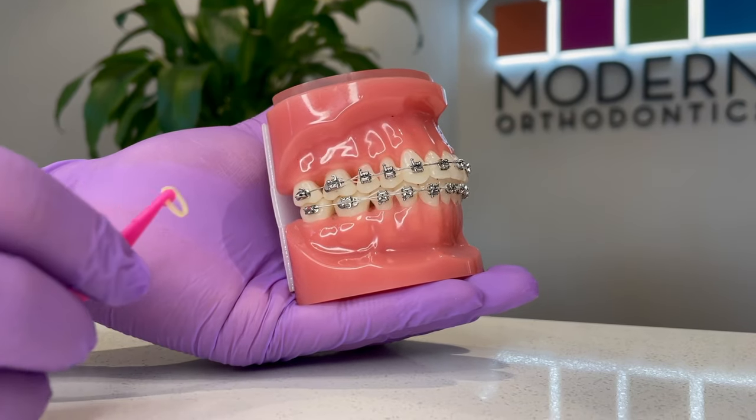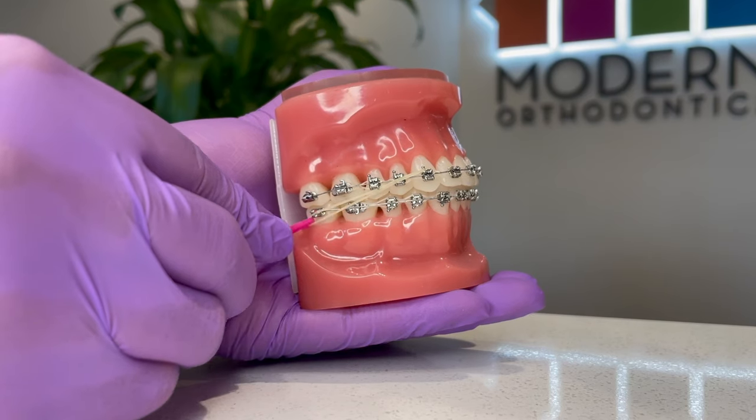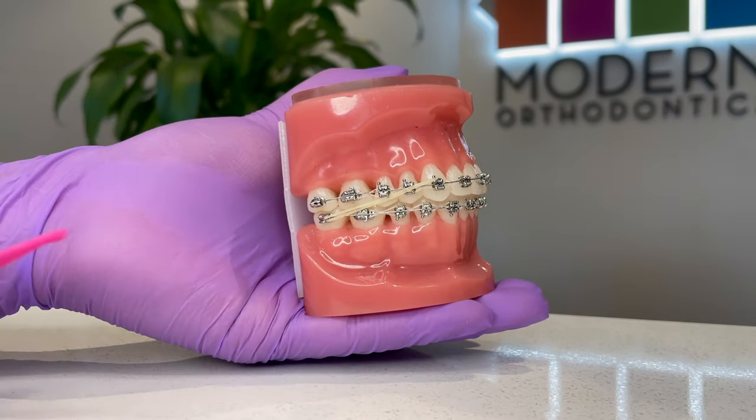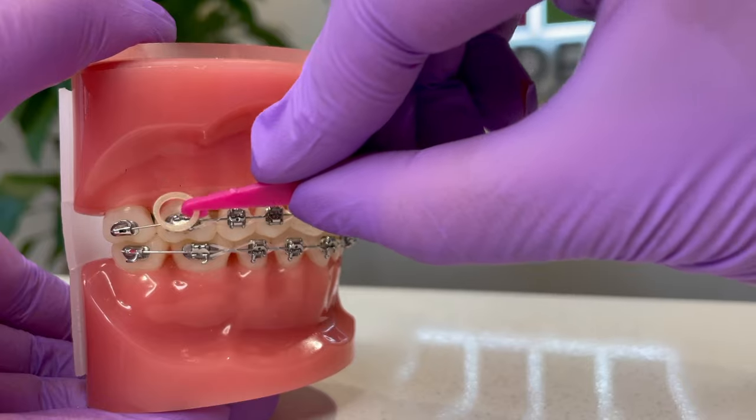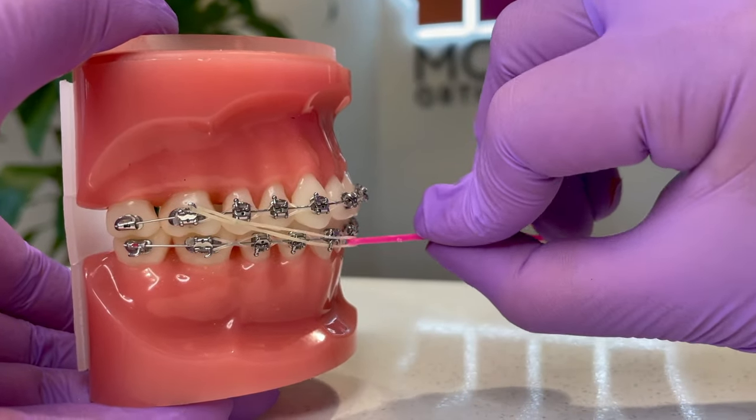If you have an overbite, your elastics will often be positioned from your upper front teeth stretching all the way to your lower back molar on both sides. If you have an underbite, your elastics will stretch from your upper molars to your lower front teeth.